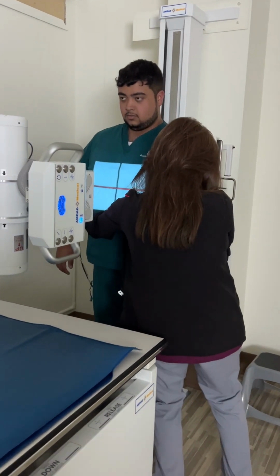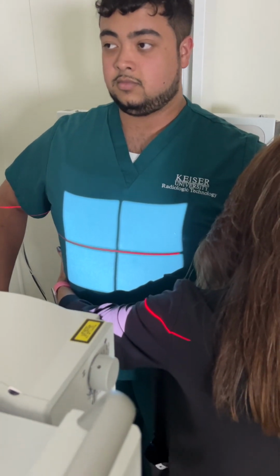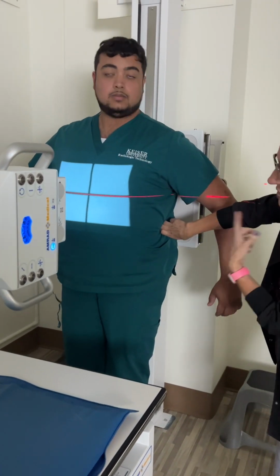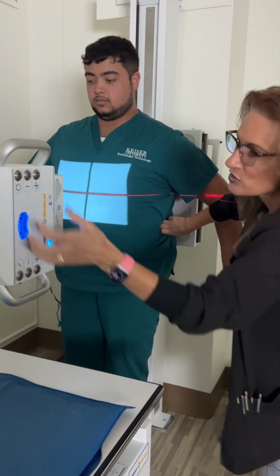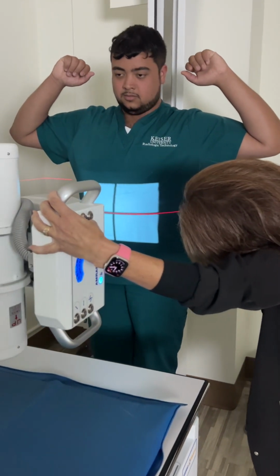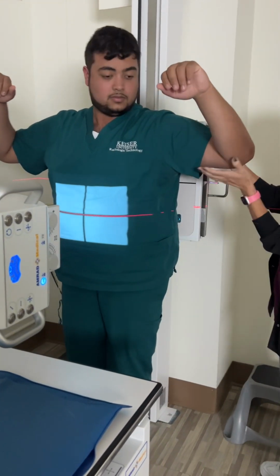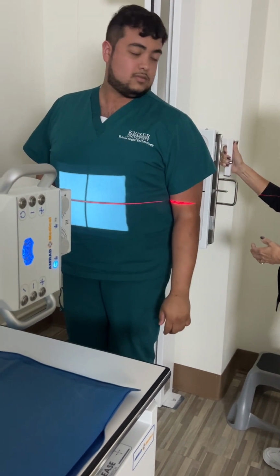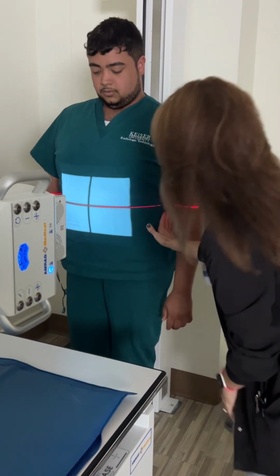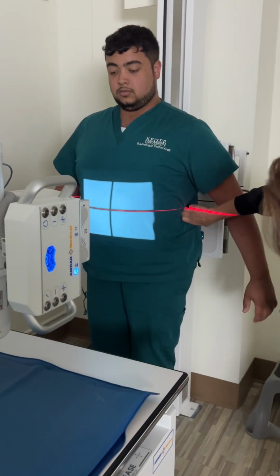And then central ray on this is 2 inches above iliac crest at midline. Correct? So 2 inches on my hand is about 3 fingers. So I am going to bring my light down to the top of my 3 fingers. And then I move the tube, so you always move the bucky. You can put your hand down, you're fine. I lied, you were right. There you go. Okay, we're aligned. So arm down. Good. So I'm going to just double check that. Crest, 2 inches above crest.